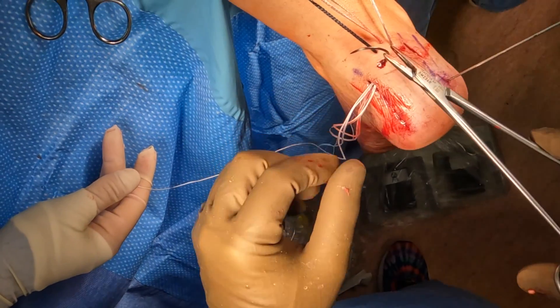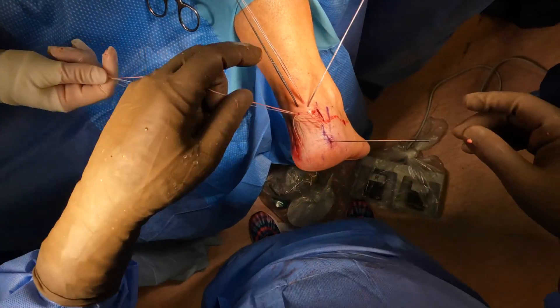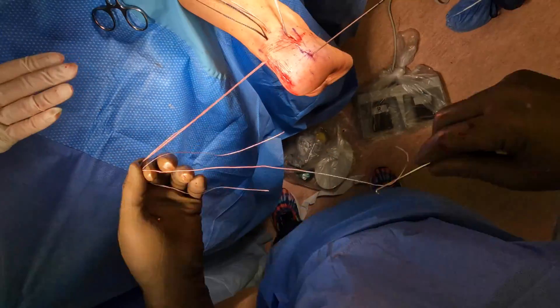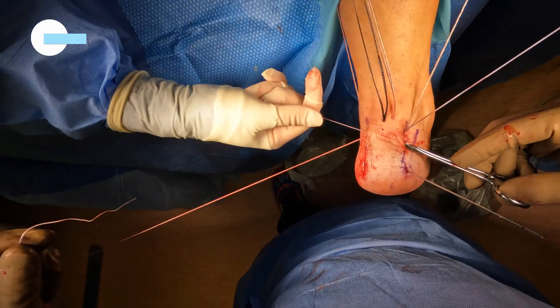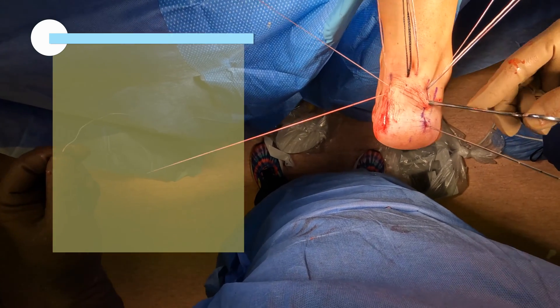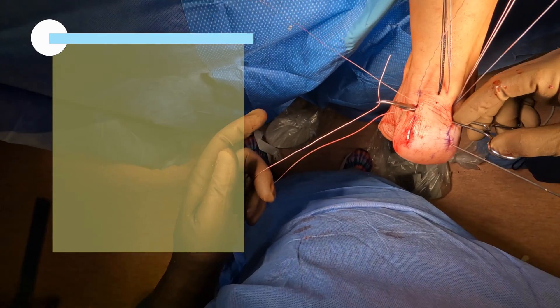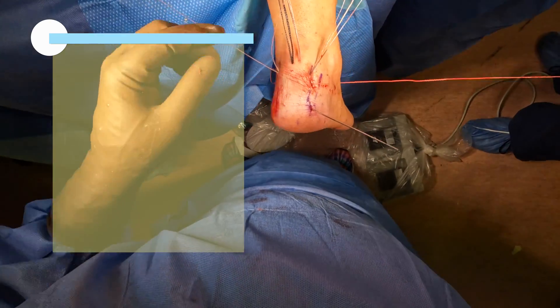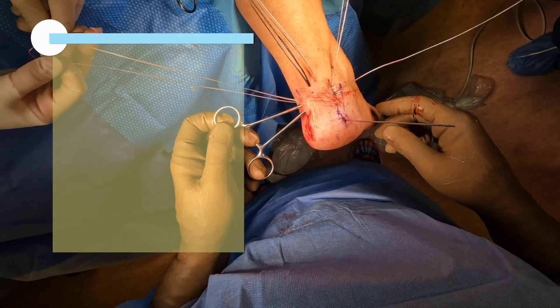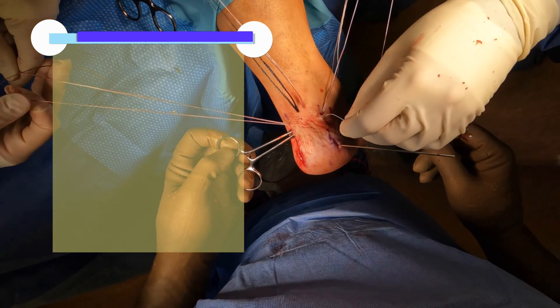The two superior and central fiber tapes are similar to the speed bridge that we use to reattach the Achilles tendon when doing an open procedure. So next we're pulling through our knotless fiber tacks, which are going to re-approximate the Achilles tendon to the back of the heel, as well as provide what we refer to as a rip stop to prevent the superior fiber tapes from pulling distally or inferiorly through the Achilles tendon. Right now I'm reaching from lateral to medial to grab these knotless fiber tacks, pulling one to the lateral side so it's inserted medially and pulled laterally. Now we're going to pull one from the lateral side and pull it out of our medial incision.